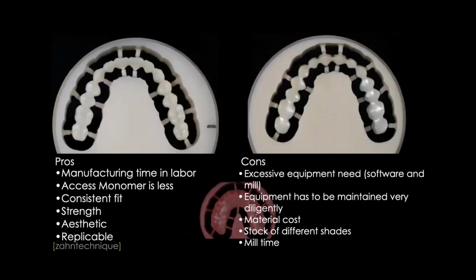We can actually mill denture teeth like you see here as a bridge and process that into a pink acrylic base. Or we can have the milled teeth, which is nice because now we can have a multi-layered block and have them in nice gradients and a nice aesthetic, and process them or glue them, almost like bonding them, into a printed base. So we have all these different kinds of possibilities now.